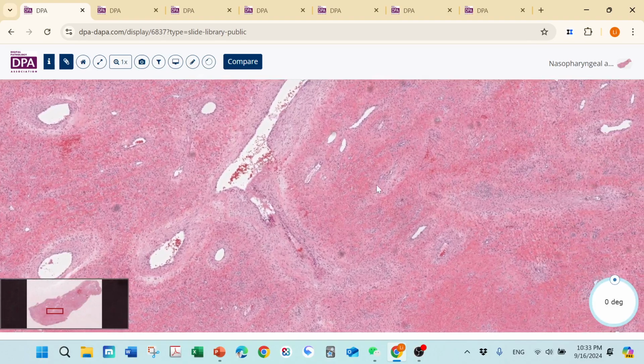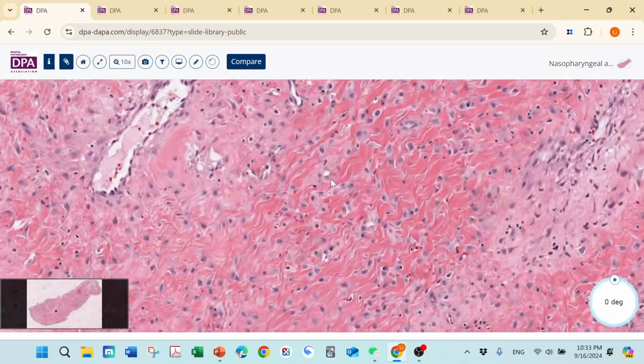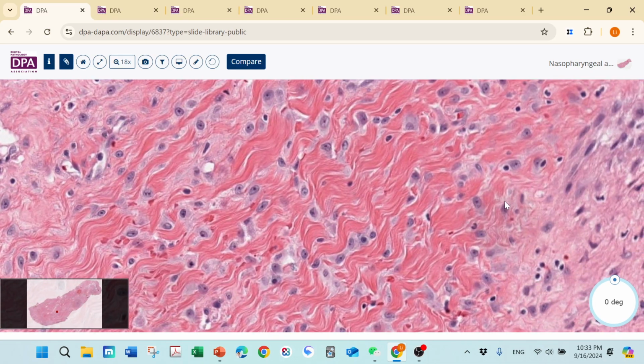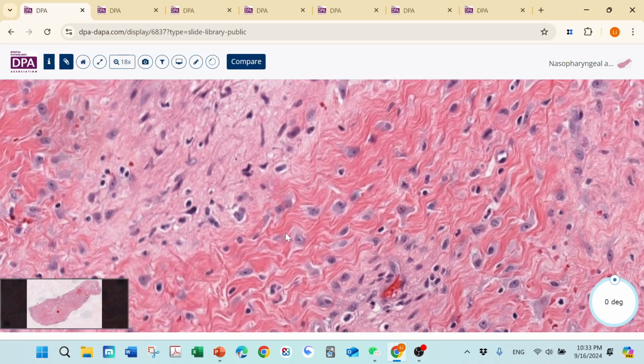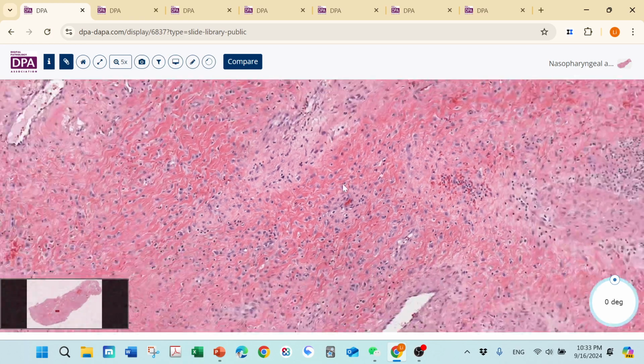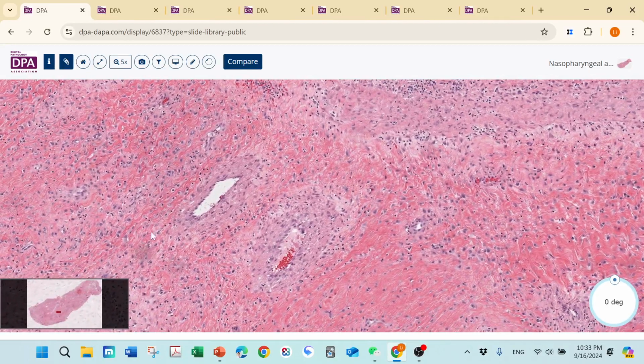And then the characteristic finding of this sclerotic stroma. And then look at these bland looking spindle cells. They are beta-catenin positive and CD34 negative. Some cells look the same, some cells have this stellate shape, a different kind of shape. Not all the cells look identical. See this stellate shape, but overall they are bland looking. So just two components: vessels and this sclerotic stroma.